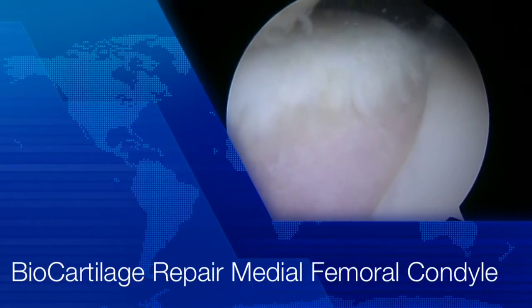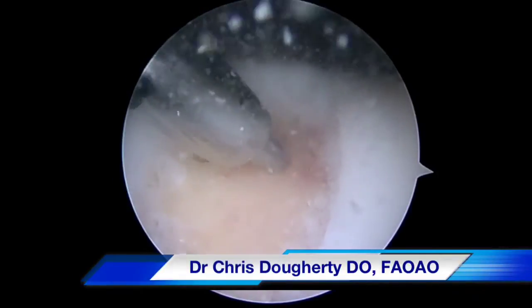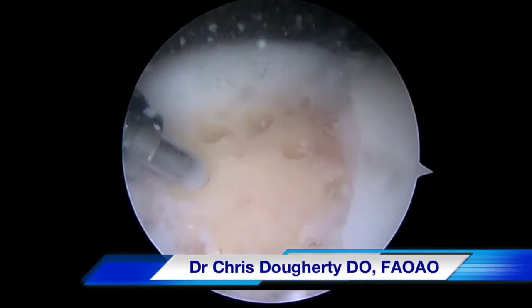This video details biocartilage grafting of the medial femoral condyle of the knee. In this case, the patient had developed a large, full thickness cartilage defect in the medial femoral condyle.